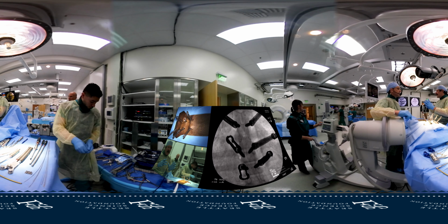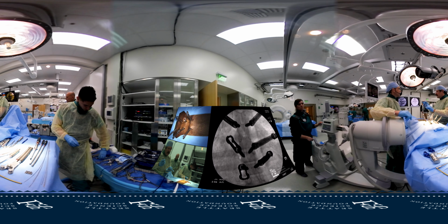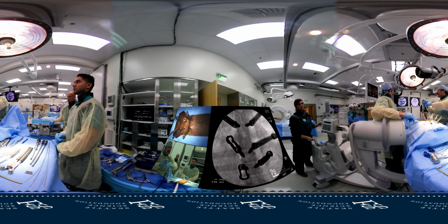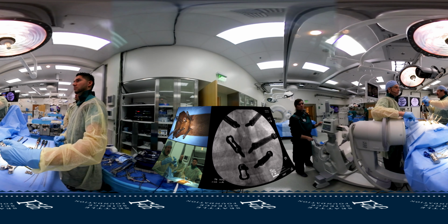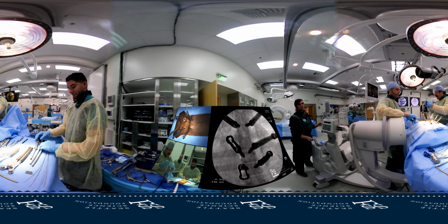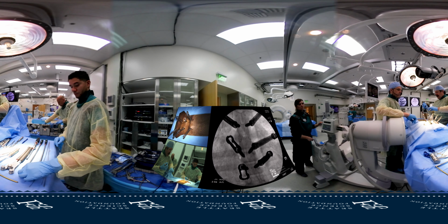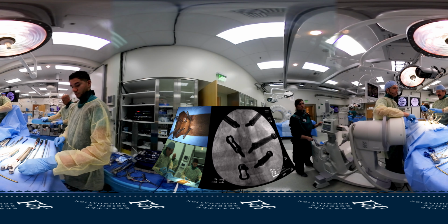If in a kyphotic spine, if in an ankylosed spine, you don't match their kyphosis just right, what will happen is you'll try to pull screws up to a rod. And because there's no motion between the vertebrae, you'll rip the screw out. If you have a mobile spine, it doesn't have to be as critical because the spine will adjust to the rod. In an ankylosed spine, it won't do that. So most of the time, if I don't think it's matching, I'll pull my rod back out and rebend it.